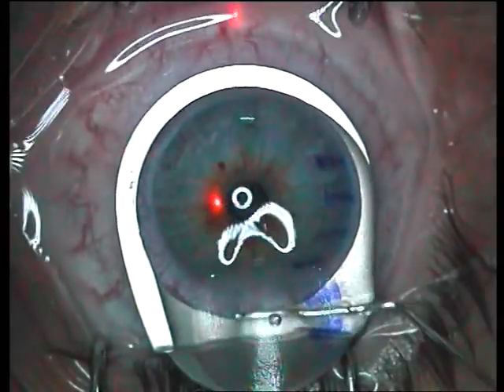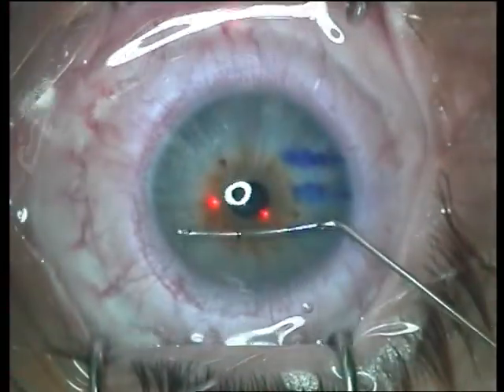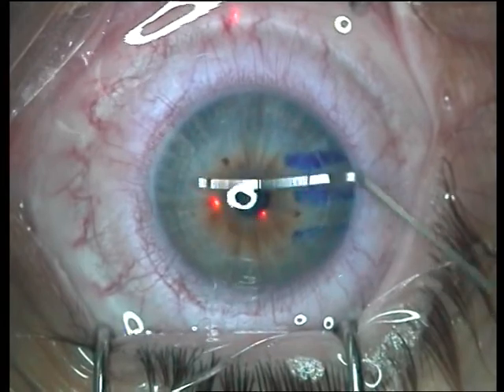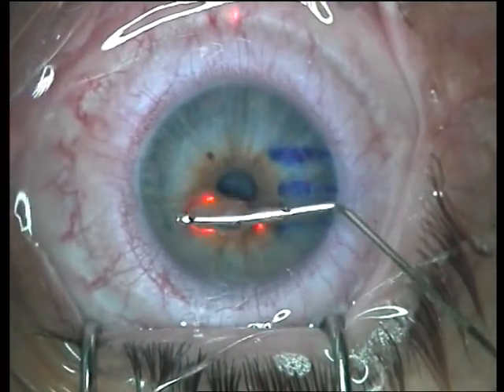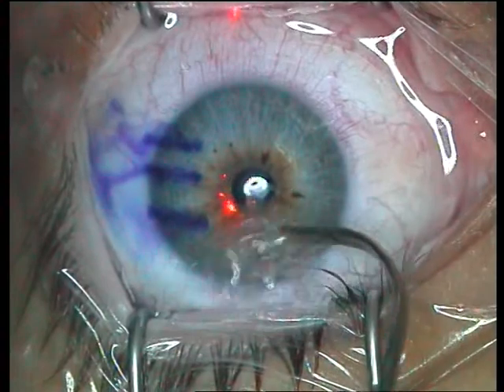The flap is washed with the Banaji LASIK cannula and gently repositioned in place. The flap rest is removed off the eye, a further wash is given under the flap, and the operation is over. After the wash, the flap is checked for alignment with the three marks, and the speculum is removed.